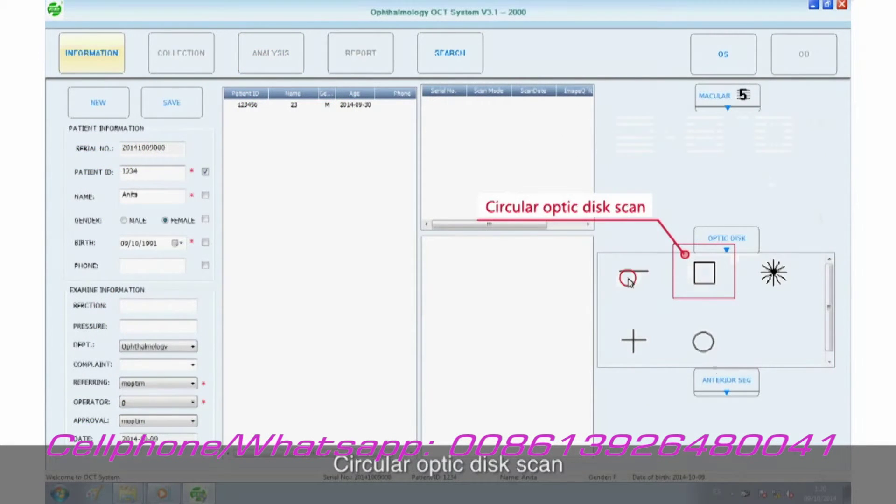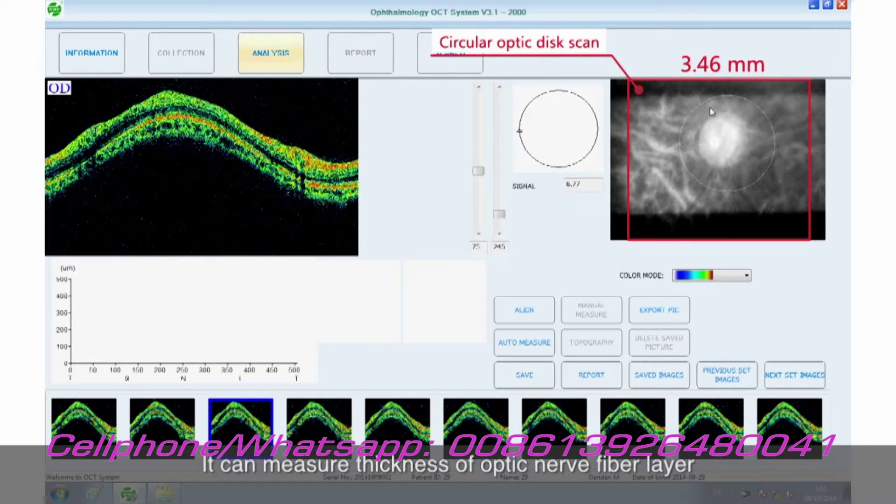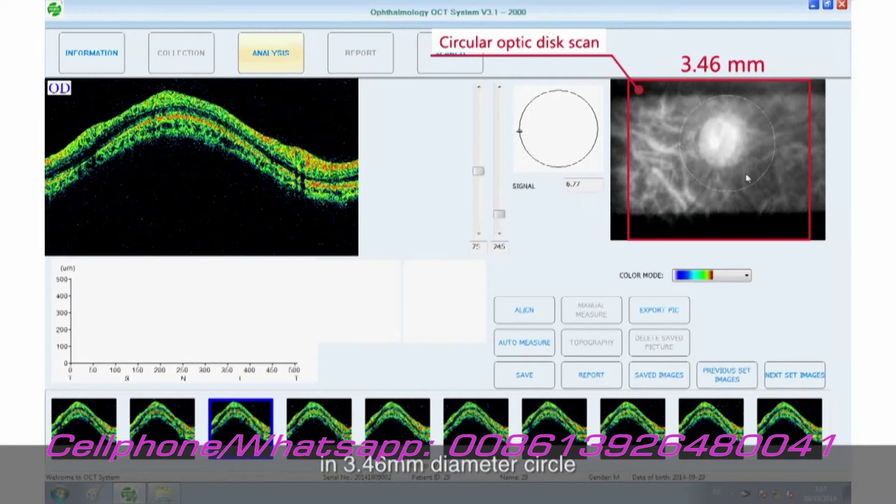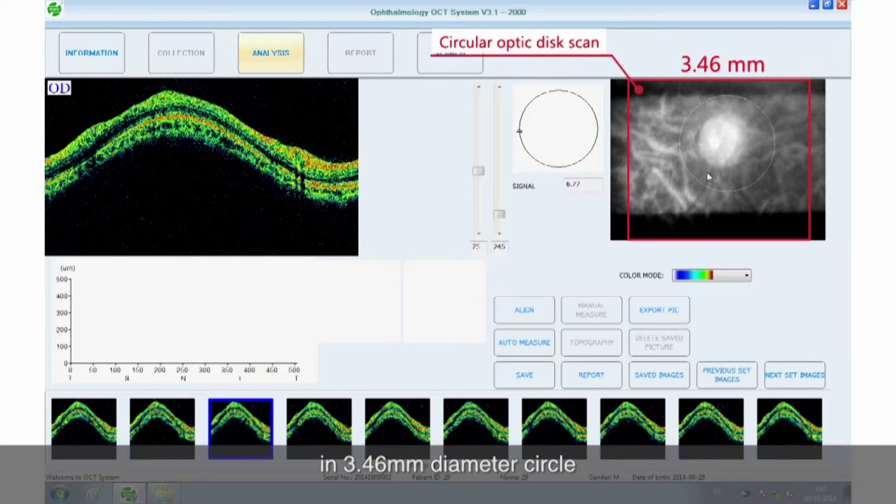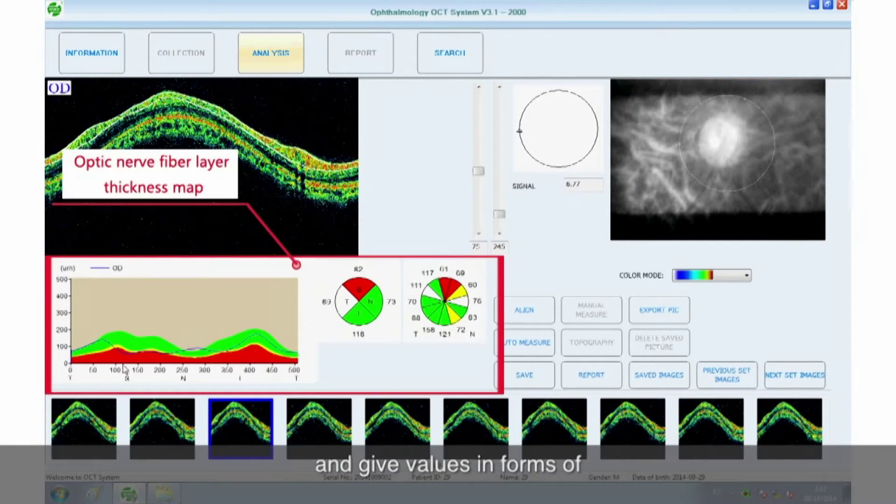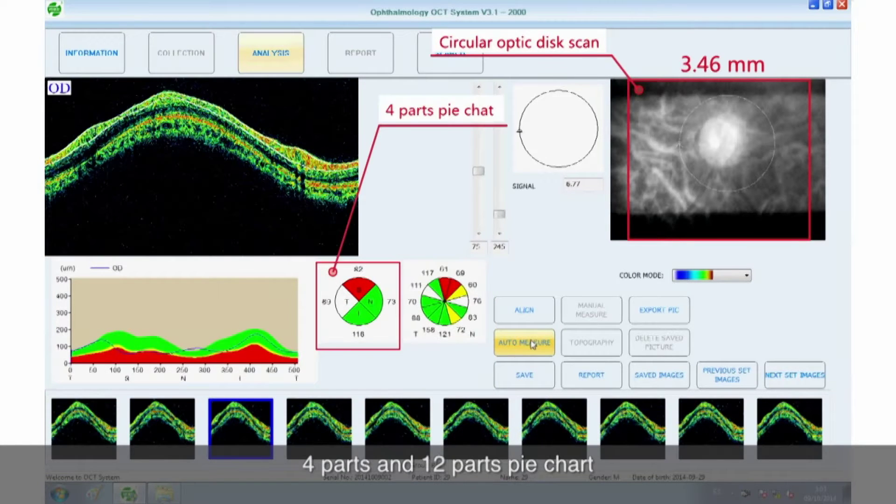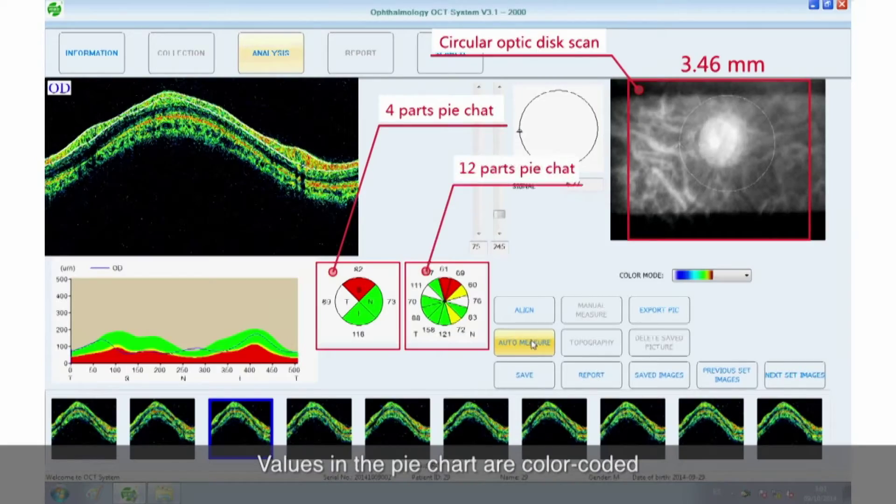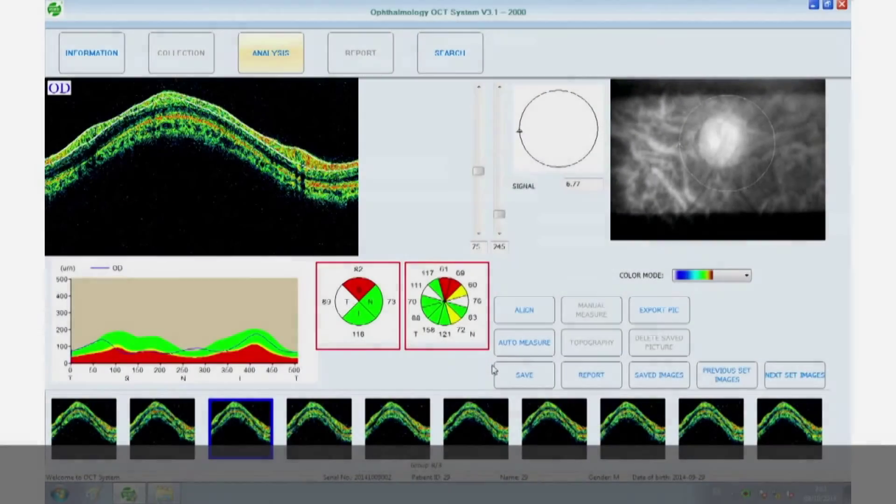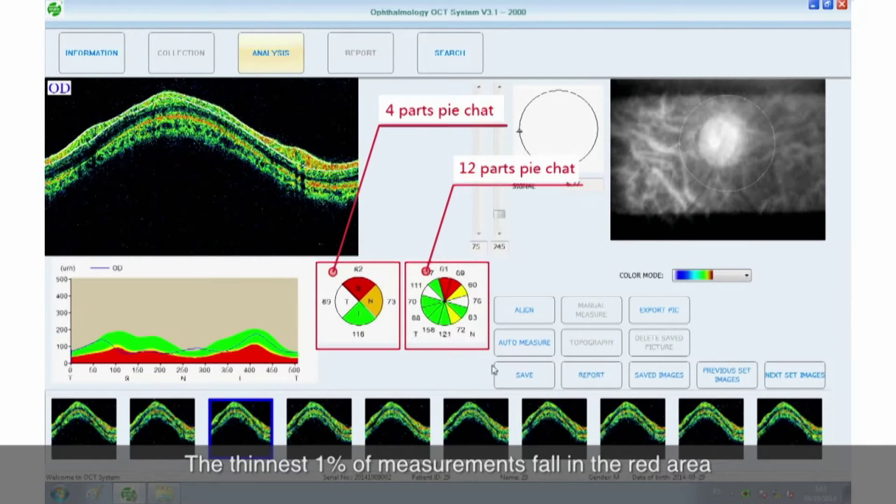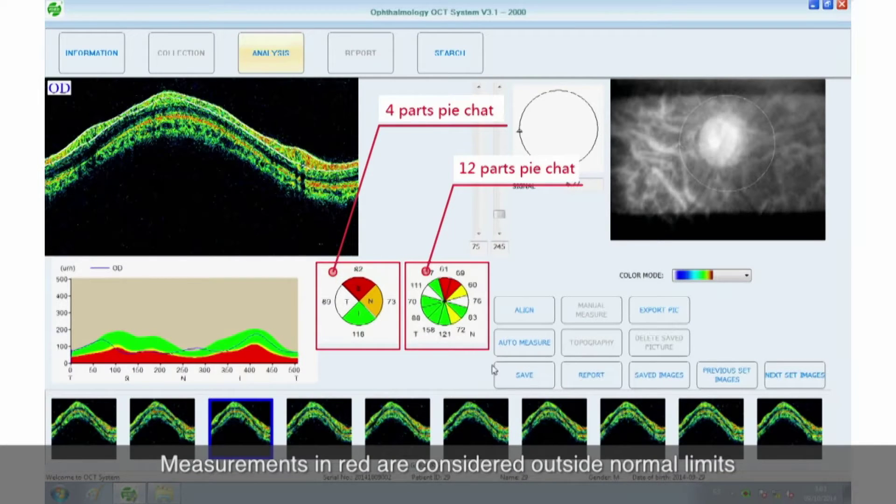Circular optic disc scan. It can measure thickness of optic nerve fiber layer in 3.46 millimeter diameter circle and give values in forms of 4 parts and 12 parts pie chart. Values in the pie chart are color coded.